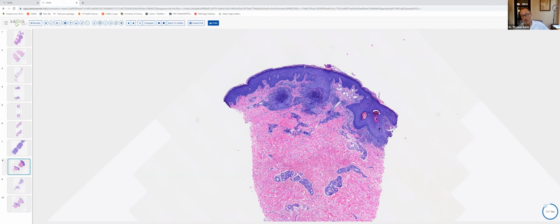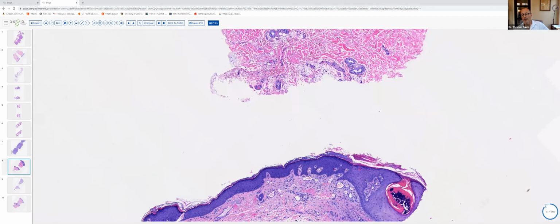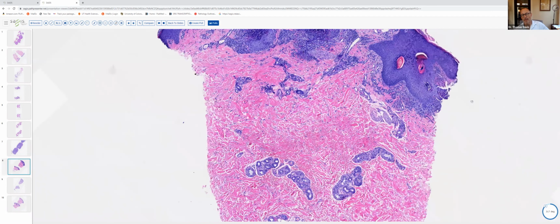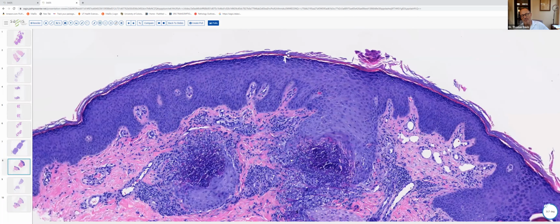We've got a hair follicle over here. This contains a hair shaft, and we've got this downgrowth of squamous epithelium, which appears to be derived from follicular epithelium. Another follicle here containing inflammatory cells in the wall. However, if we go down and look at this squamous channel, we can see that it has somewhat of a pincher shape, okay? And there's a little cup-shaped invagination.